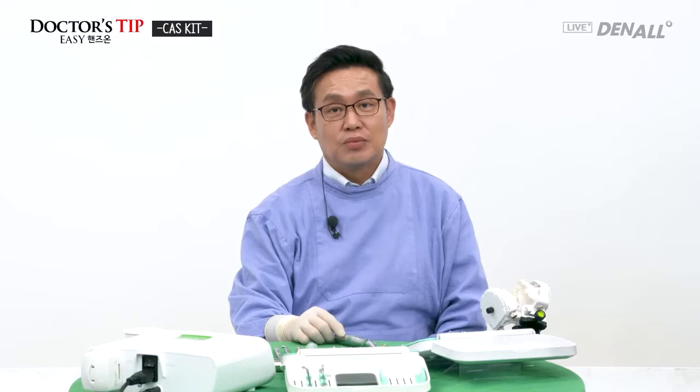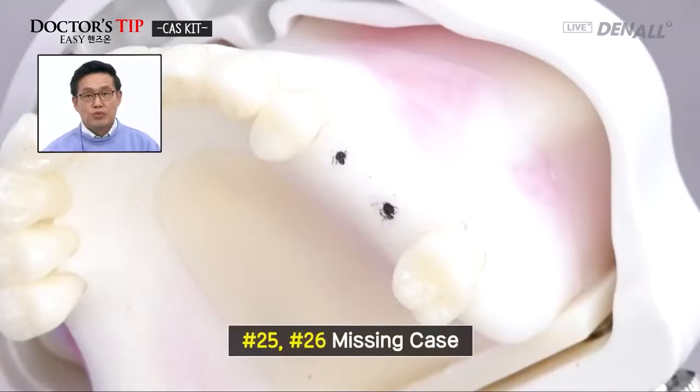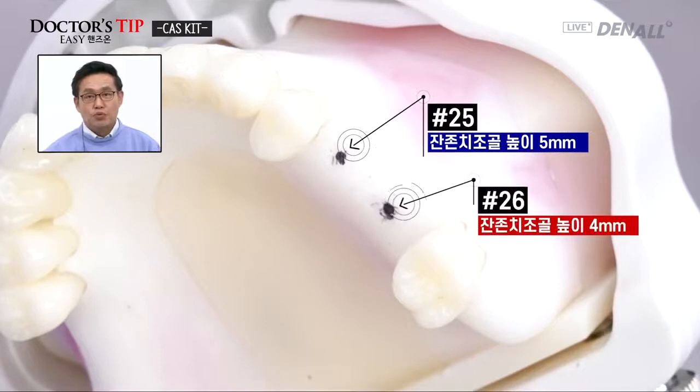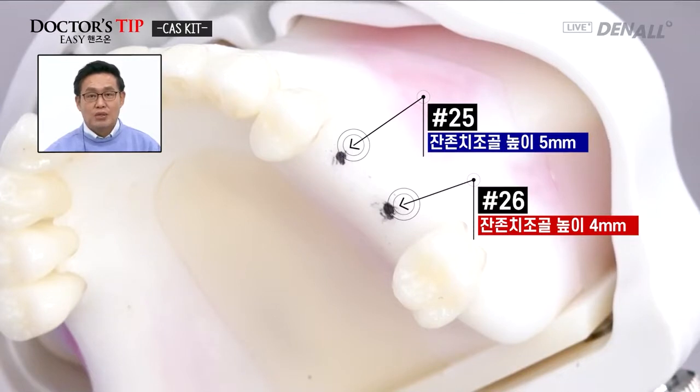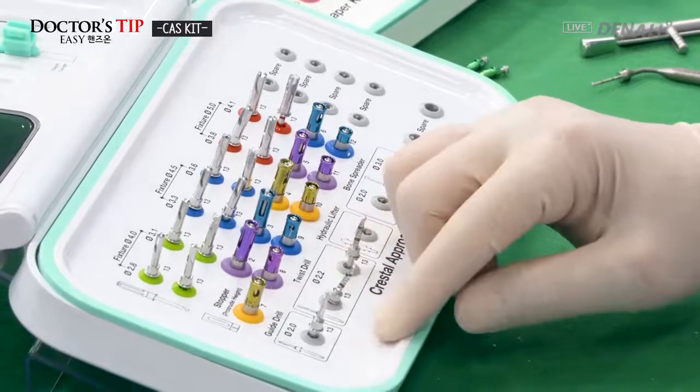CAS KIT hands-on. In this practice, 25 and 26, two teeth, are missing. At 25, the residual alveolar bone height is 5, and at 26 it's 4 millimeters. But the alveolar bone is slightly sloped near the adjacent teeth. Therefore, we need to go deeper to penetrate into the sinus floor. Now let's start the hands-on.